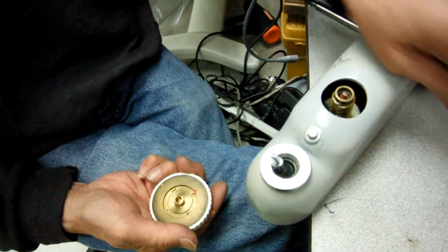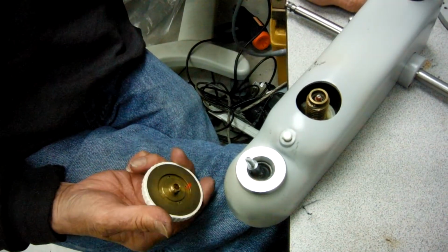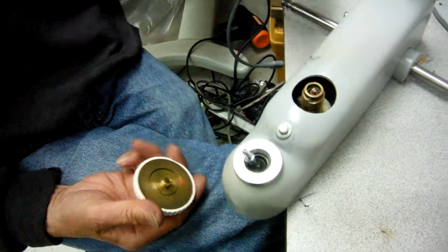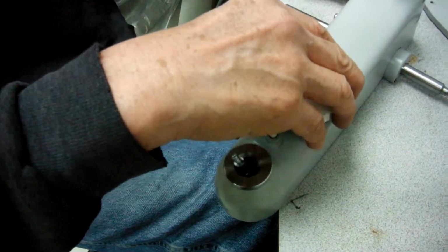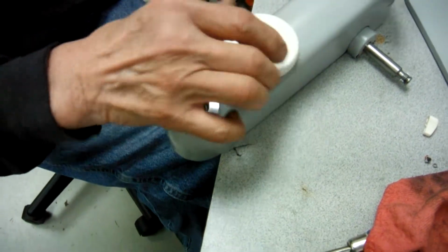But sometimes you put this one in there and you cannot even go all the way down to hold it in place well. So I think we need to take that one off, if you want to. If you don't want to, you can leave it in there.